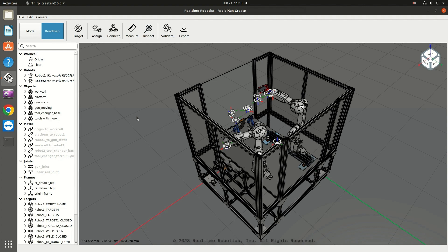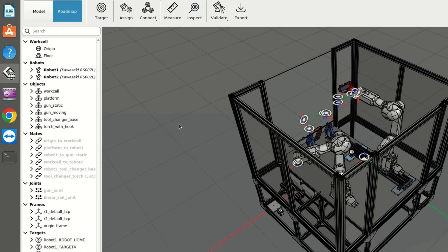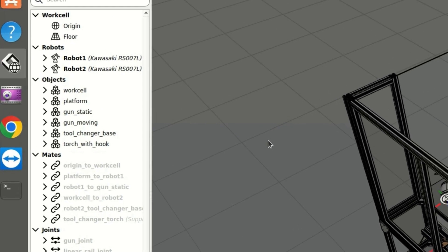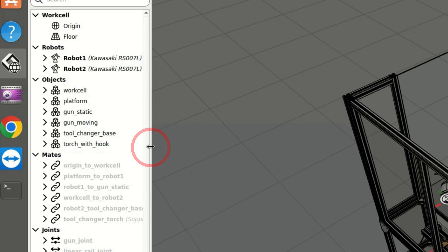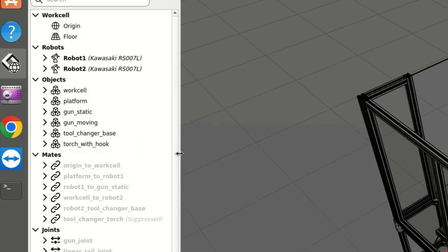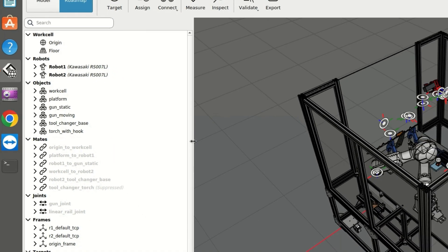First, let's look at the RapidPlan Create window itself. To resize the panels horizontally, hover your cursor over the vertical line separating the 3D view from the property tree. When it becomes a two-headed arrow, click and drag to resize the panels.